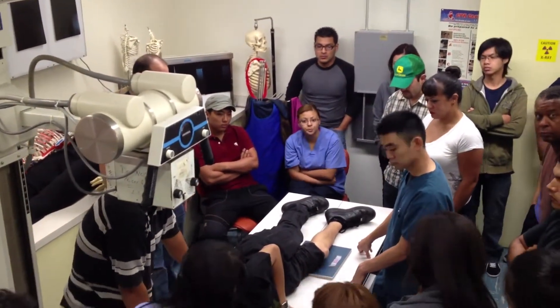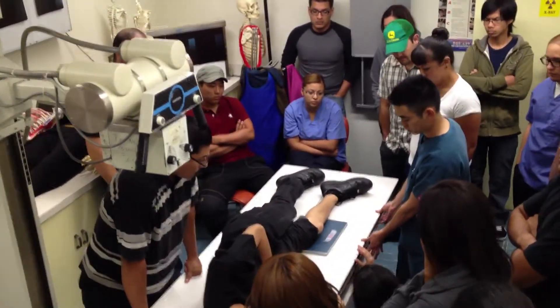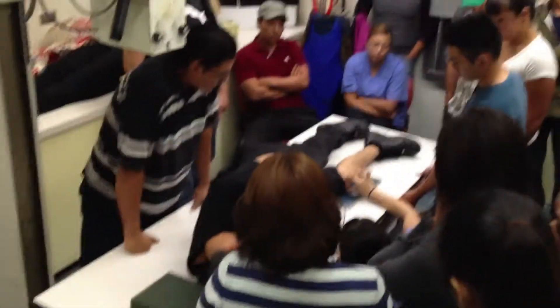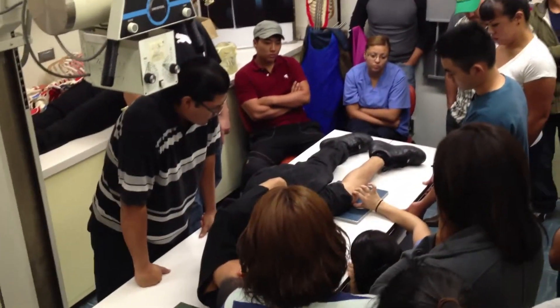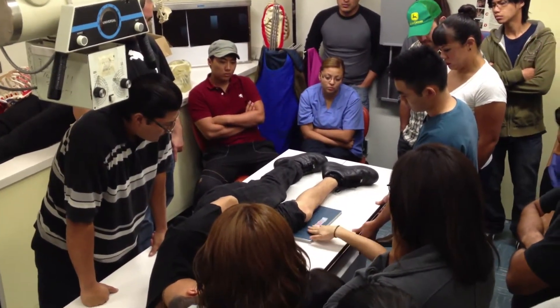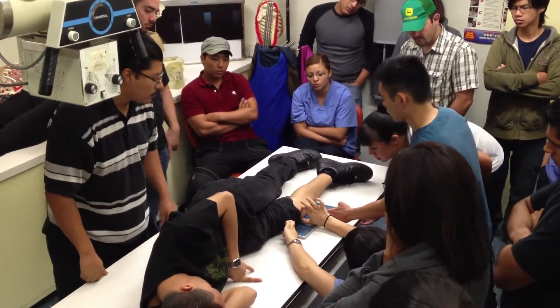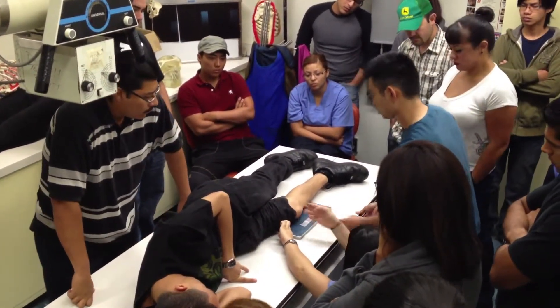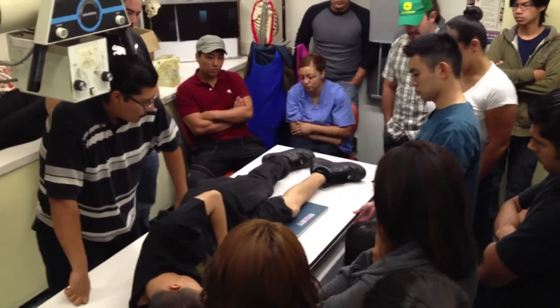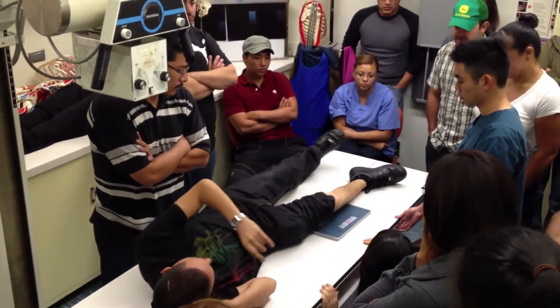That's the way I do my CR on it. I go up two fingers and then come down a bit — if I see the patella coming down a little more, I come up a little. It should be parallel. Make sure it's parallel, perpendicular. That usually gets the lateral cleaned up. Is someone going in through the patella area? I'm not grabbing at it, just showing you — you want to palpate lightly and say okay.